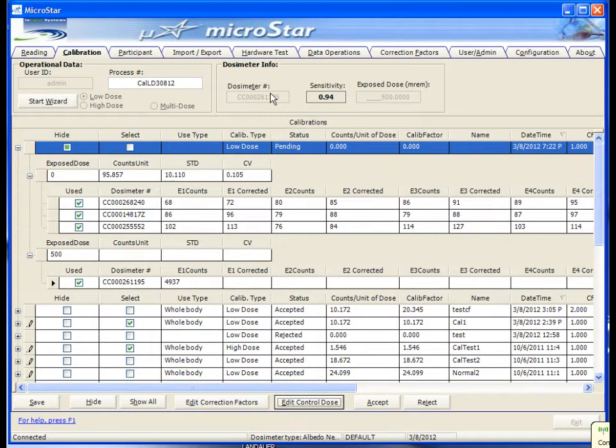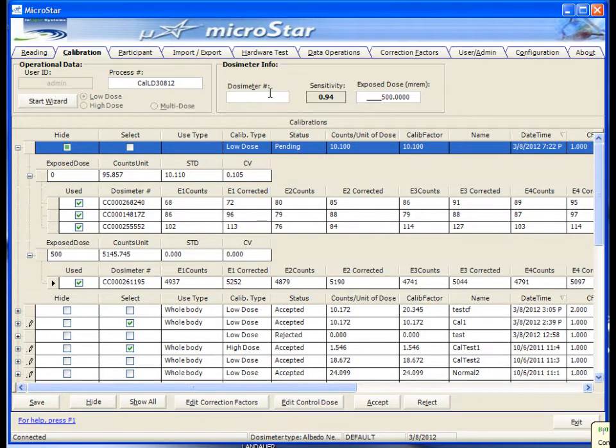As each new dose is read, the grid will expand into sections showing the values for each dose. Continue this process until you've read all three badges of each dose level for this calibration.